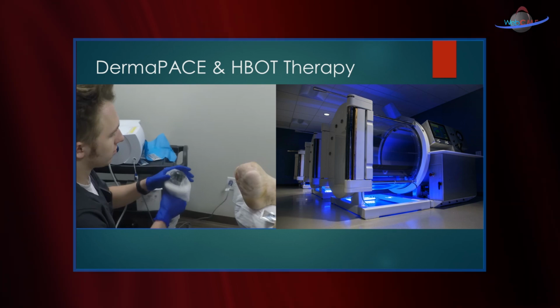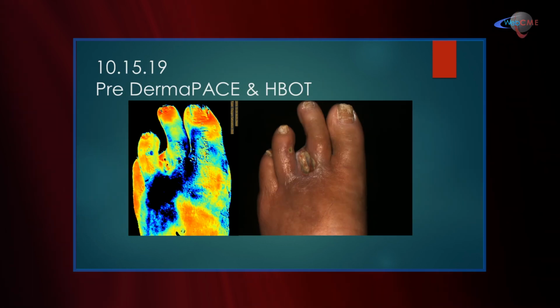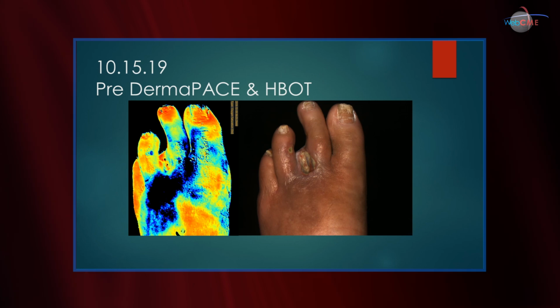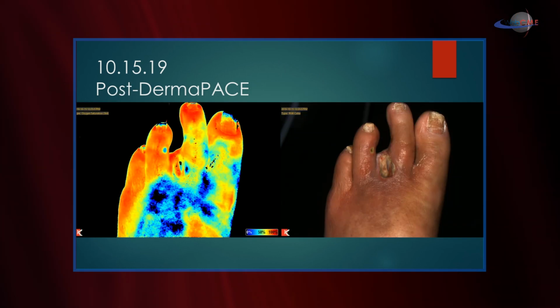Yes. So the question is, can we see this with the camera? Very interesting. We did a DermaPACE and a hyperbaric, and here is a photo looking again at a digital image compared with the snapshot, a near-infrared imaging, right, John? Yeah. And that's pre-DermaPACE, pre-hyperbaric. Here you see the image post-DermaPACE therapy.